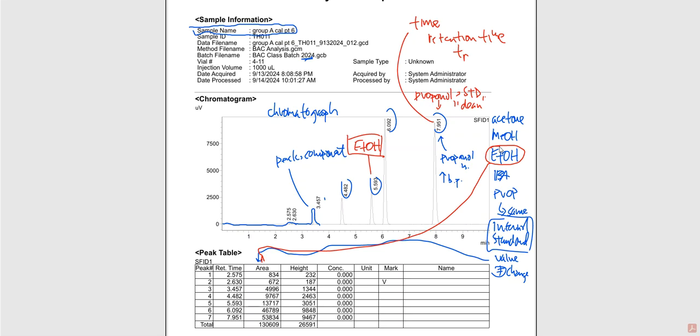And then again, this here on the very end, this is our, not IPA, this is our propanol that we have used as an internal standard. Hopefully what we'll see is that this ethanol peak, we built a series of standards. There were a total of 6. And that series of standards went really, really tiny, and then it went more concentrated, more concentrated, until that peak gets bigger and bigger.